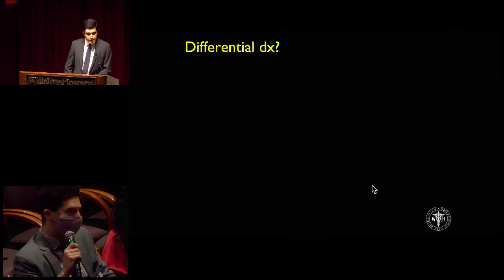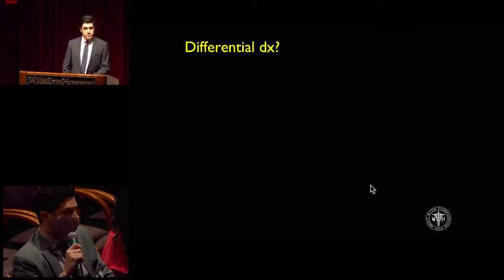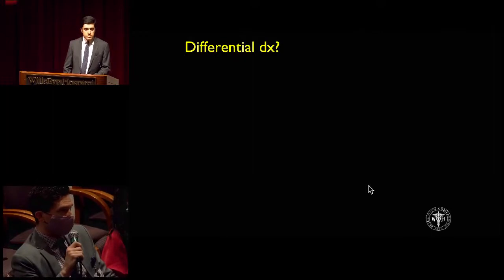So I haven't really given any history, but what would be your broad differential for such a lesion? Yeah, so acute onset vision loss with profound outer retinal loss, RPE involvement, and then also a focus of possible subretinal hemorrhage. I think the first thing I would be concerned about might be some sort of a traumatic insult. Maybe this is a type of commotio, and there's a focus of choroidal rupture out there in the nasal periphery.